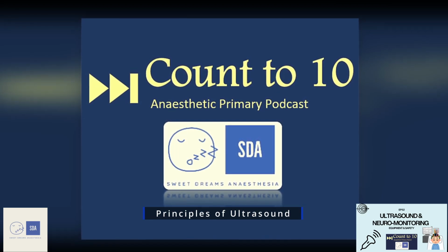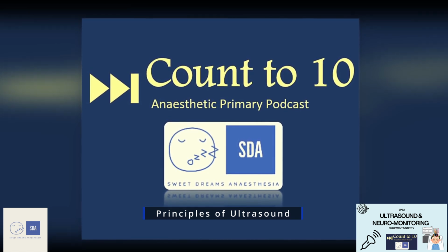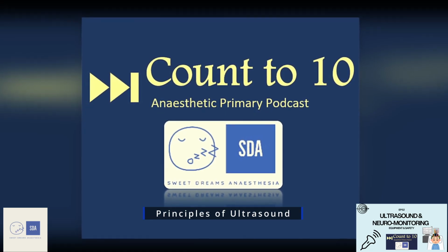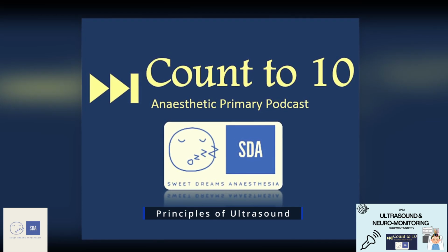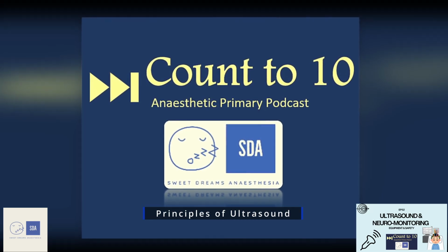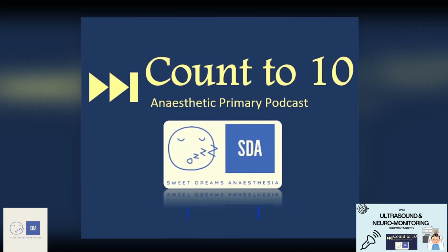With your settings as well, you can change where you want to optimize your ultrasound depth penetration. You can change the field of that ultrasound view to make it narrower or bigger, and you can either focus in or out at an ultrasound image to improve the clarity of the thing you're trying to look at. All of these have their upsides and downsides, and it's beyond the primary content, but it's important to know from a clinical perspective how you can modify the ultrasound despite maybe limited probe selection to give you the best image to succeed at whatever procedure you're doing.